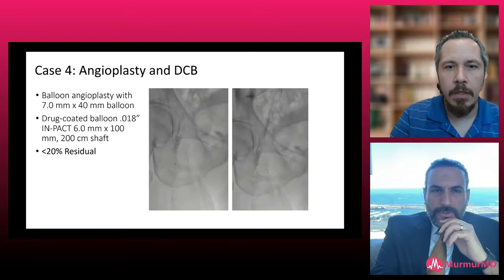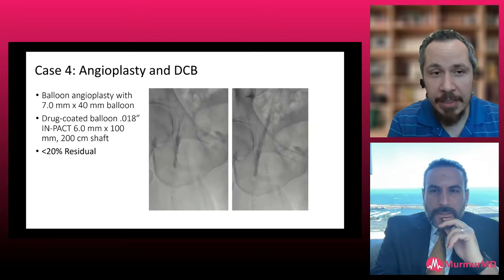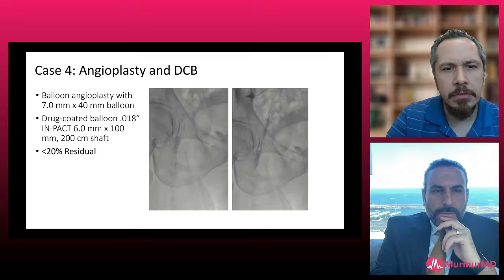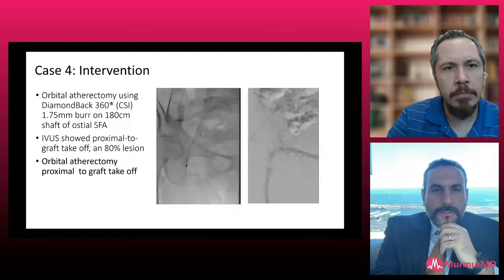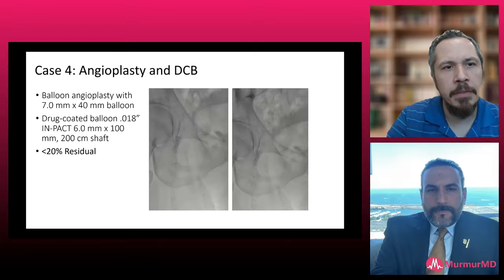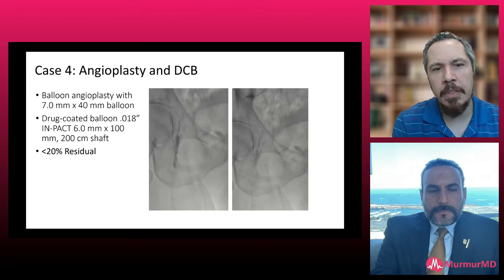I mean, any consideration for just using IVL there, or is that probably before your IVL days? No, we actually did IVL at this point. Oh, well, actually, let me see. Maybe we didn't. I don't think we did. No, I don't think we did. I think we did atherectomy, and then I did a balloon angioplasty, and ended up with a DCB.